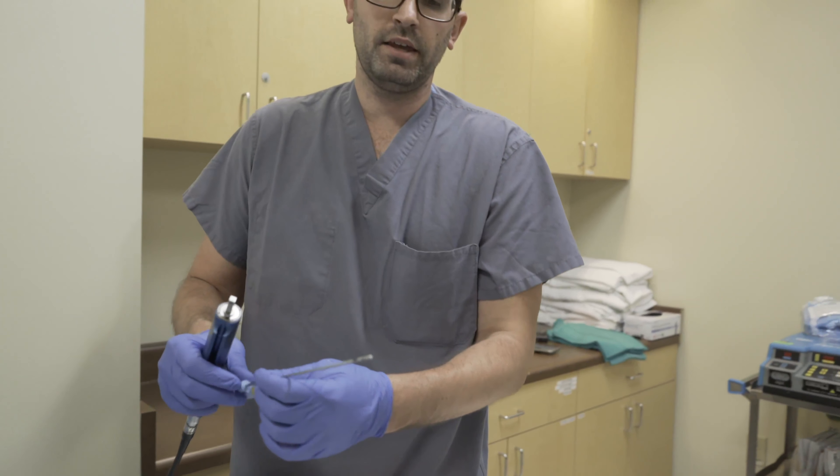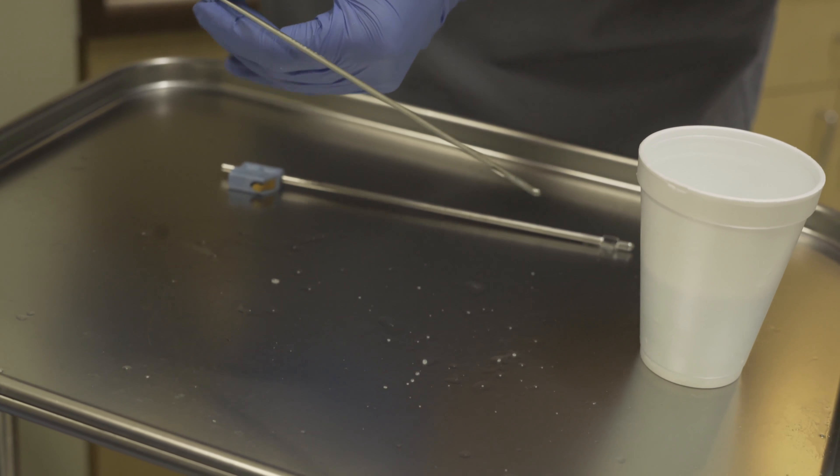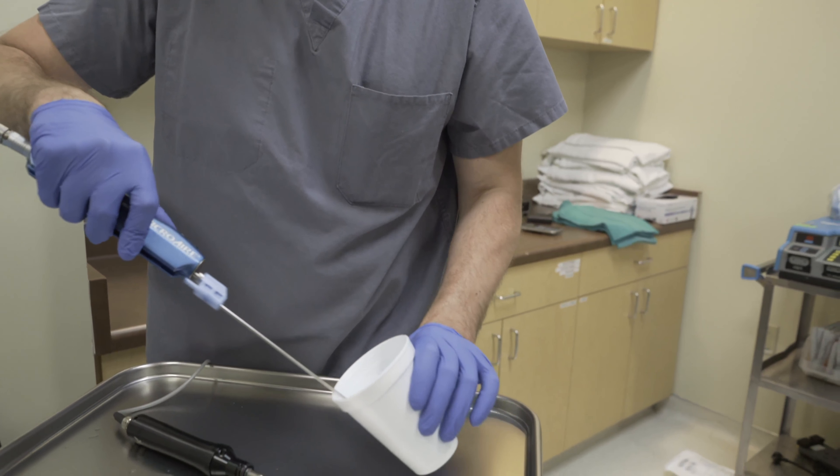Next we come through with the actual suction cannula. So we've gone through tumescent injection, ultrasound to break it up, a basket cannula to break it up, and now we're finally going to get in and start sucking this out. We put it on vibrate — so fast you can barely see it move — and then we put it in to actually suck that fat out.